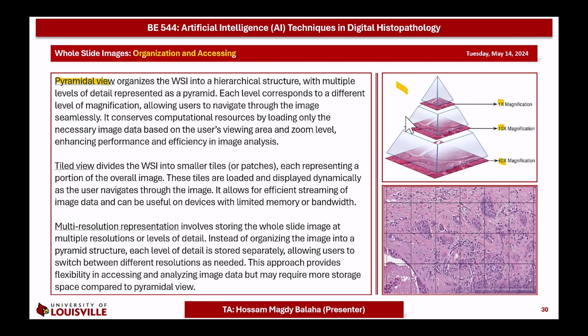It makes it like levels, so the top level is the lowest resolution, and when you get deeper and deeper, you are getting more and more detail. So if you are targeting an abstract view of the whole slide image, you can present the top one, while if you are going to work on the fine details or the detailed structure of the nuclei or the cytoplasm and so on, you can navigate to higher magnification levels such as 10x or 40x.